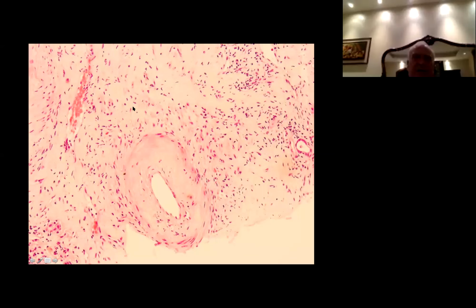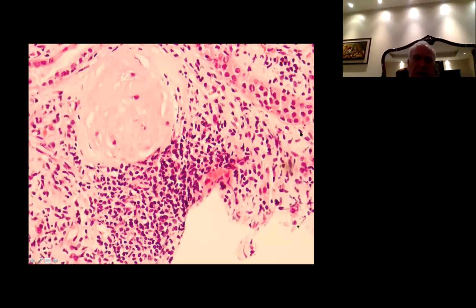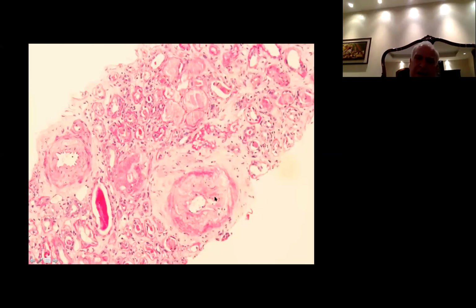That's a sclerosing glomerulus. That's the area of interstitial infiltrate, possibly due to the drug that he received. See here, that's the infarcted area, special stain, that's the blood vessels. Look at this. That's the intima, and all that's really thickened. Same thing.